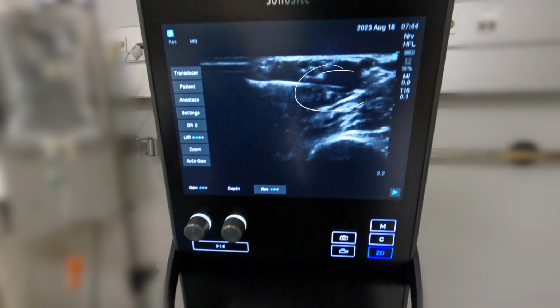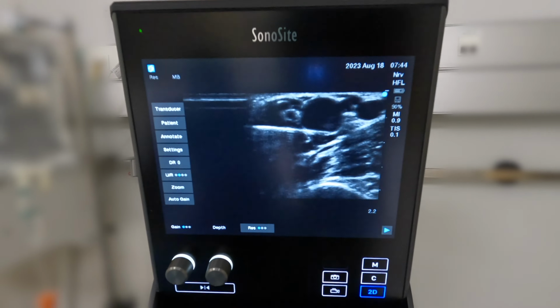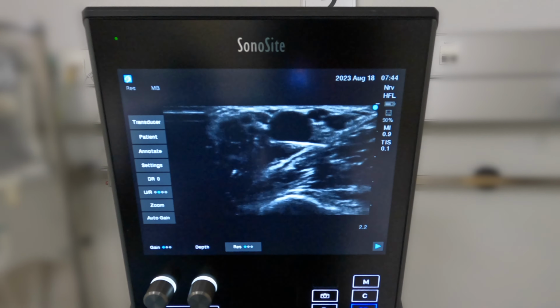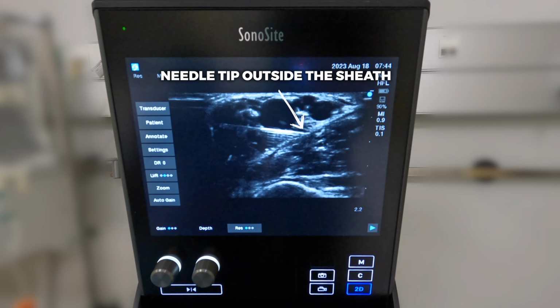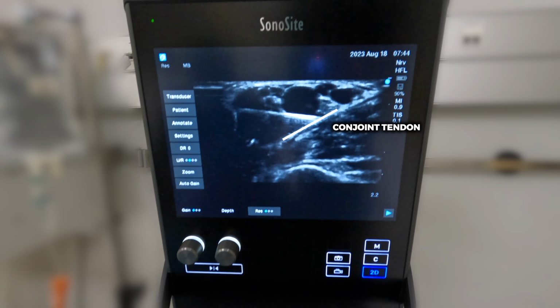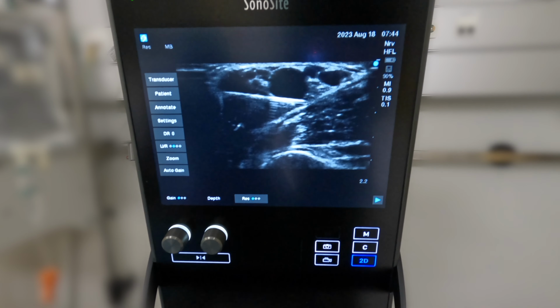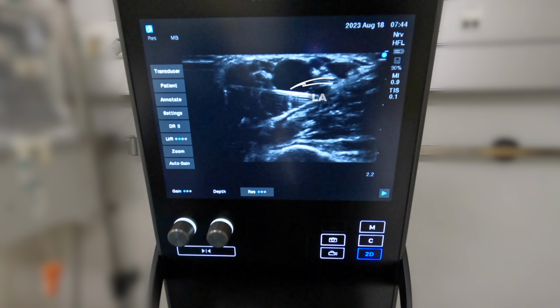Yes. Okay. So let's see where the tip is now. And bring your anatomy back in the middle. There you go. So you're right. Okay. So pull back a tiny bit because you may be through the conjoint tendon. Yes. Okay. So here, this injection should result in a substantial spread in the axillary plexus sheath. There we go. That's what you want.